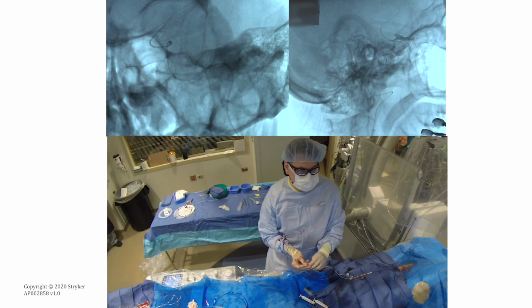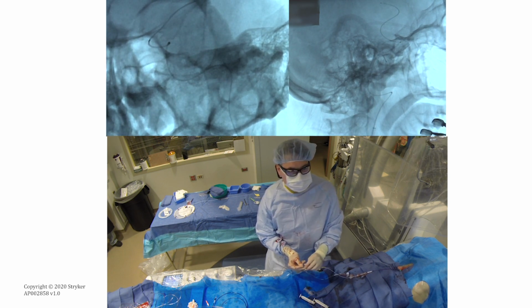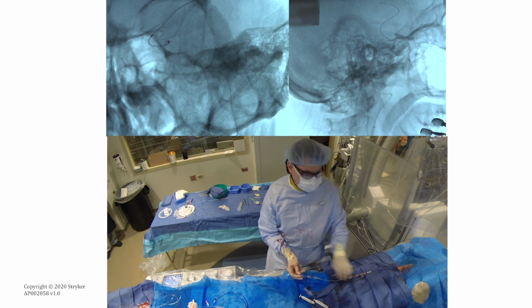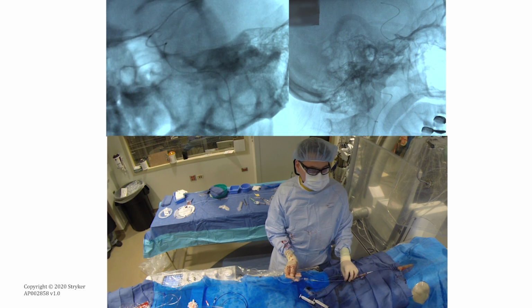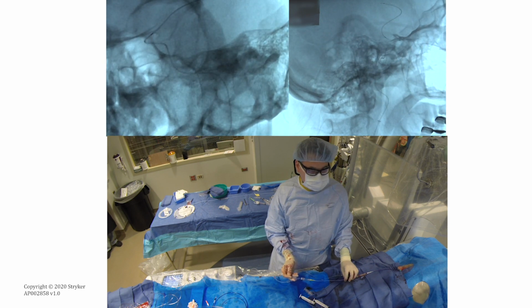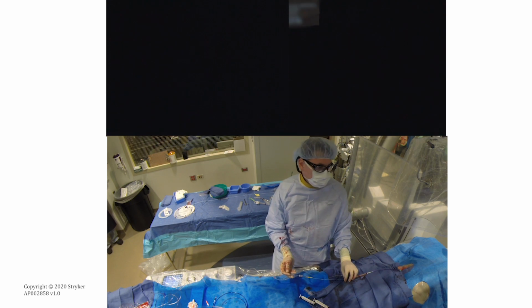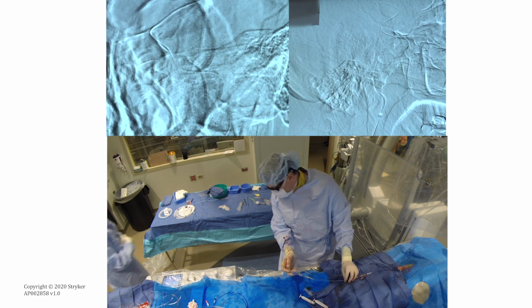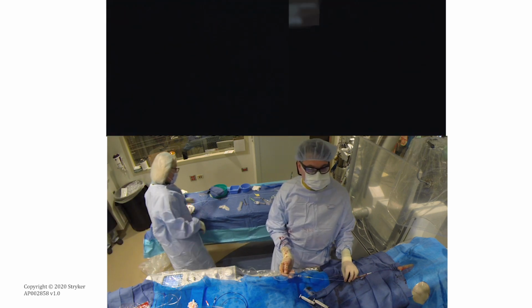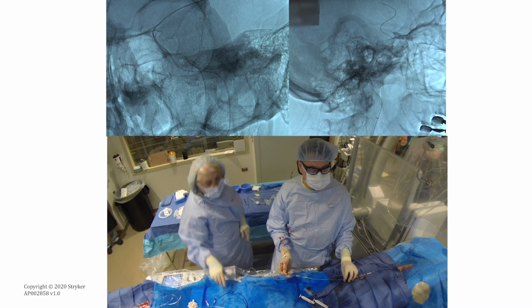So the Trevo is going up despite a significant tortuosity. You see the position of the balloon guide at about the C2 level, and now you're going with the Trevo without significant movement of the patient's head. It seems to be relatively well tolerated, despite a significant navigation challenge with this tortuous anatomy.